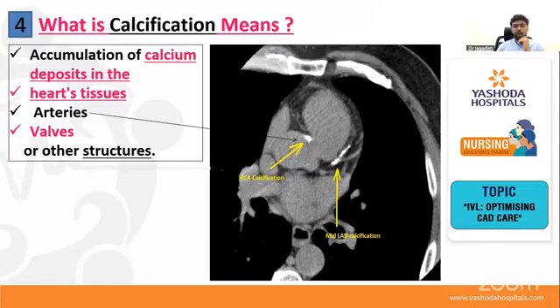Yes. The angiogram itself may not be sufficient all the time, because the angiogram is the first modality of choice before deciding on IVL. Once we do an angiogram, this is a whistleblower. If we see calcium in the angiogram, then we suggest another modality like imaging, such as IVUS or OCT.